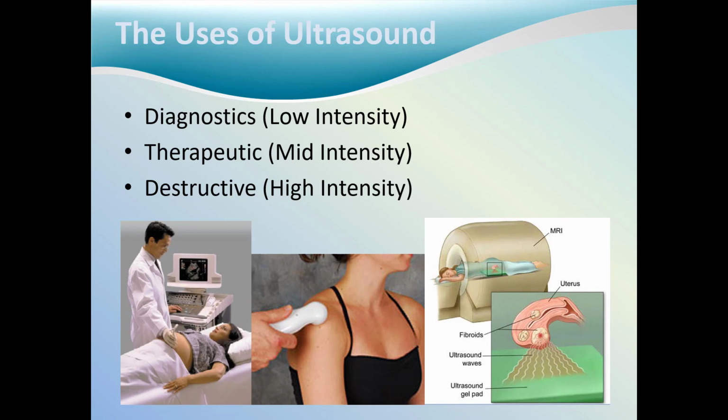At 1 centimeter below the fat surface, a 4-minute warm whirlpool set at 105 degrees Fahrenheit raises the temperature approximately 2 degrees Fahrenheit. At the same depth, a 3 megahertz ultrasound can increase the same tissue to a temperature of over 10.8 degrees Fahrenheit. Therefore, if the purpose of the treatment is deep heat, an ultrasound would be a proper modality to choose.